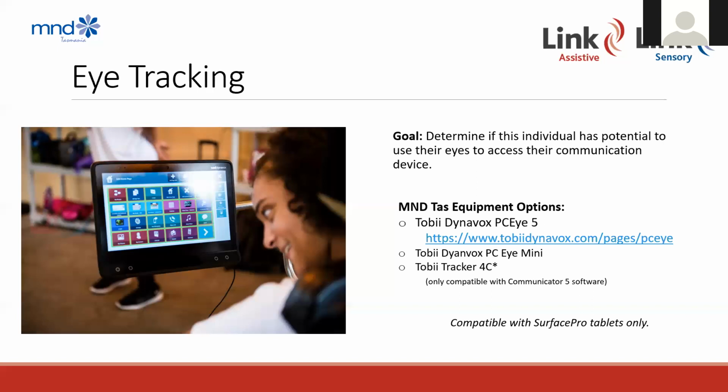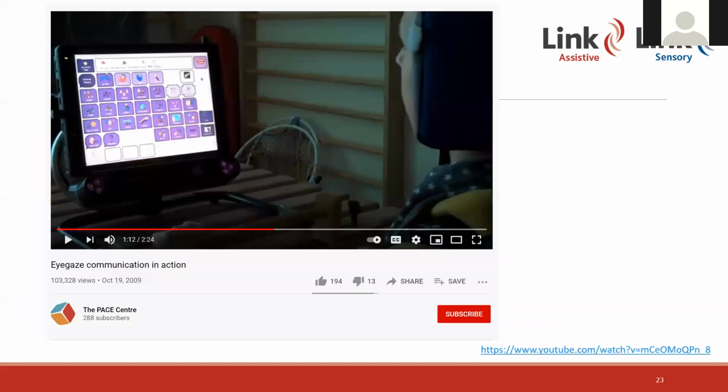Traditionally, you will see a dot or something coming up on the screen that shows you whereabouts you're looking. And what you need to do is hold your gaze steady for a set amount of time to enable a click function. Holding your gaze steady for the set amount of time is referred to as dwell. So you have to dwell and look closely and steadily at an item, and that will click. You've got adjustability in terms of how long you have to look at the item to get the click, so you can make that slower or faster depending on what the person needs. But that's the traditional eye gaze access method.